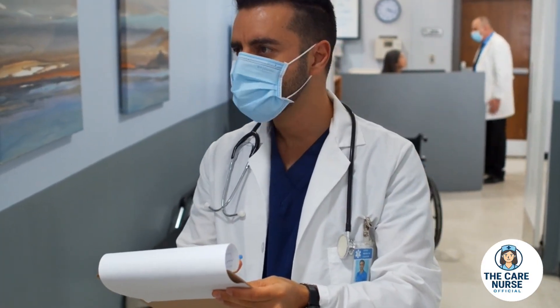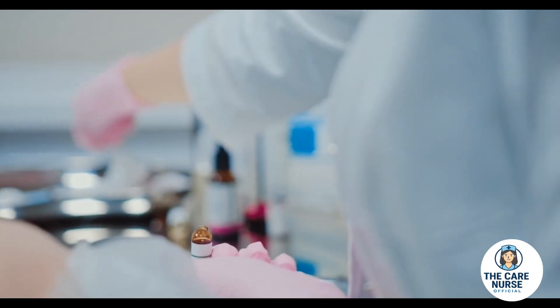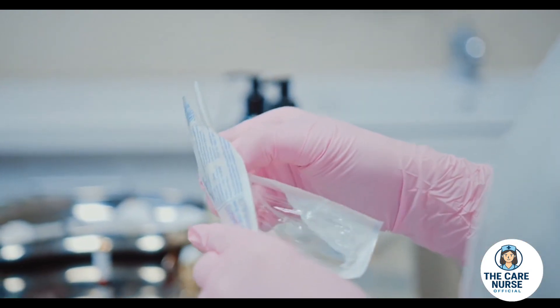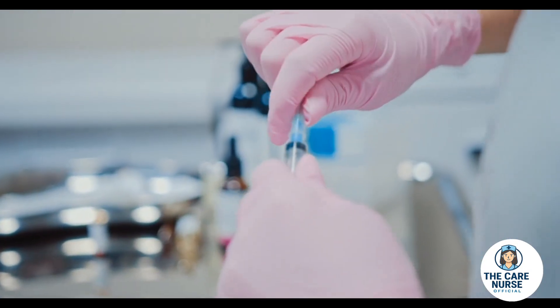The nurse begins by verifying the patient's identity and consent, then prepares the medication, confirming dose, label, and expiry. Wearing gloves and maintaining aseptic technique, the patient is positioned comfortably with dignity and safety in mind.